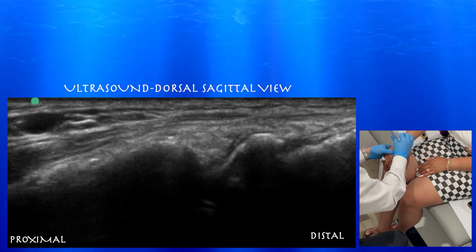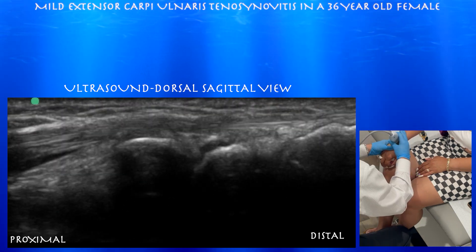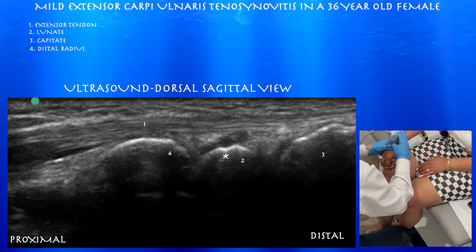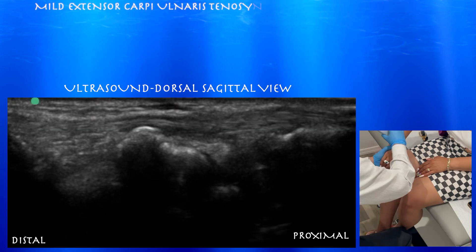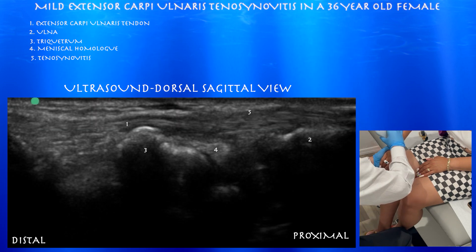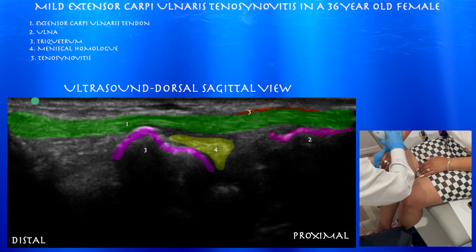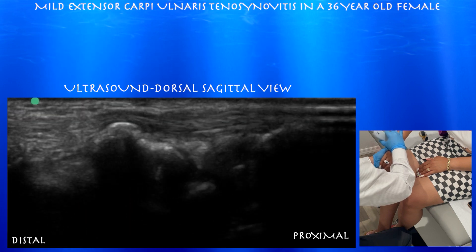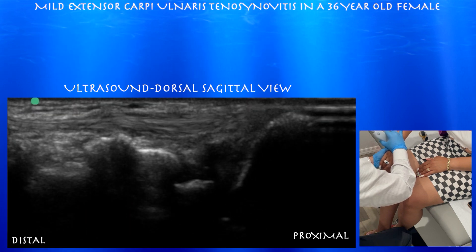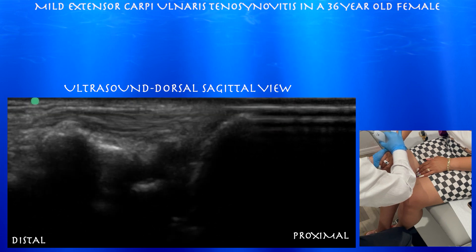Here we're going towards the mid-wrist, where you can appreciate the capitate, the lunate, and the distal radius. Here we're essentially at one of the extensor digitorum tendons of the mid-wrist. Here again you can appreciate that meniscal homologue, and a little bit of tenosynovitis over the extensor carpi ulnaris tendon just around the ulna.